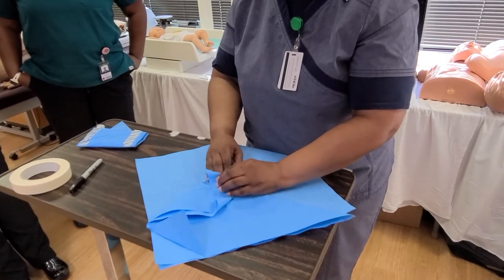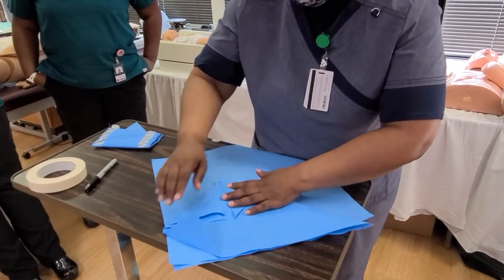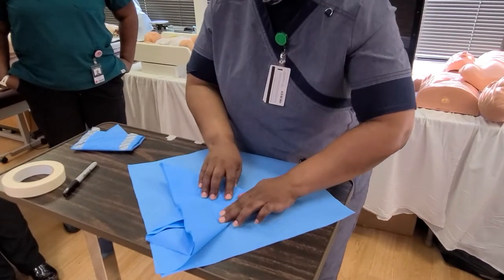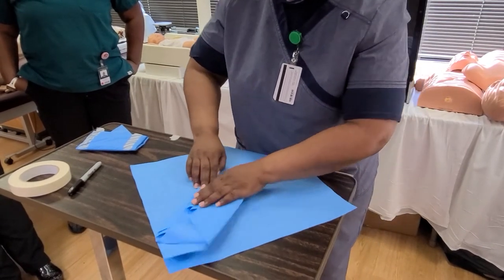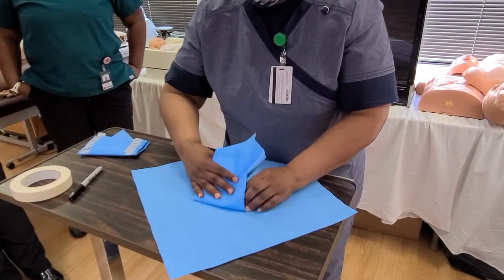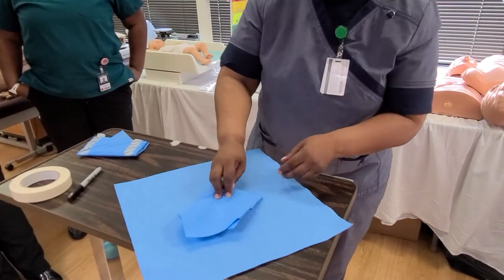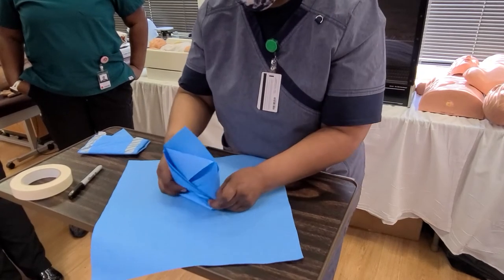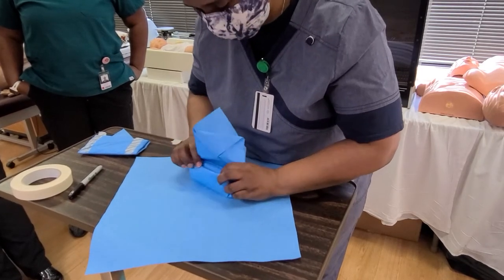Then another flap — I'm going to try to make it as neat as possible. It doesn't always come out neat, but we try our best. Now put this side — smooth the edges out and then pull this back, because I need a flap. It almost looks like an envelope, right? Now I'm going to bring this over. I have a little pocket here, and I'm just going to tuck this in, into my little pocket.